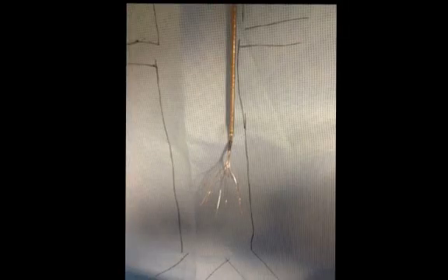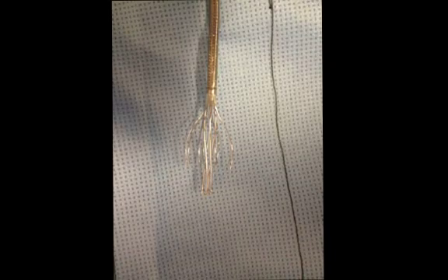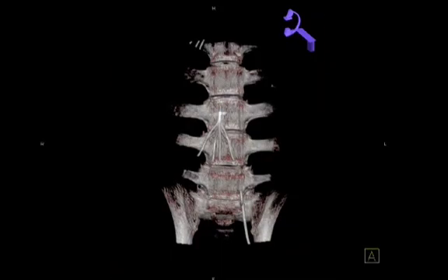Conceptually, this is essentially what we are dealing with. The filter is placed in the inferior vena cava, the robotic catheter is advanced close to the tip of the filter, and through this we can advance a snare. The snare is then used in traditional format to capture the filter, and in this case the select filter will come back fairly easily inside the robotic catheter and can be removed.